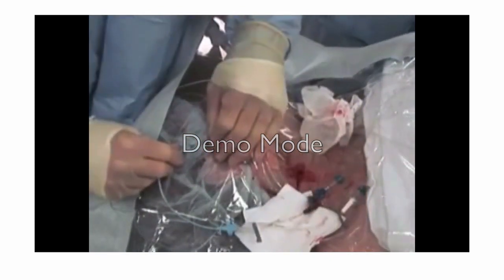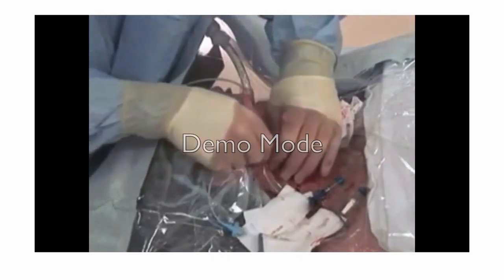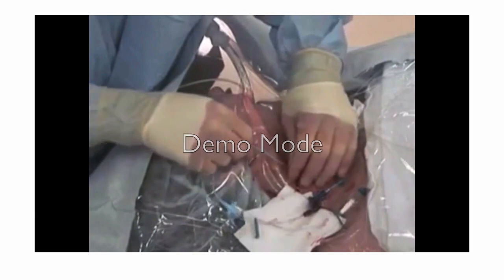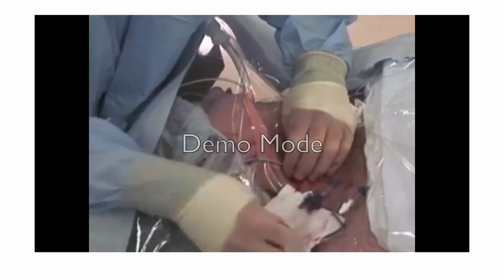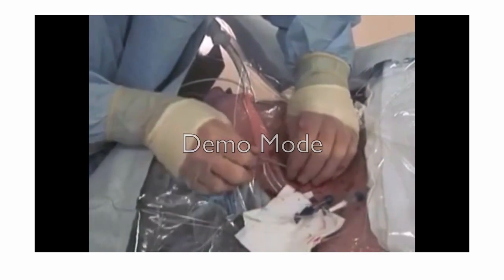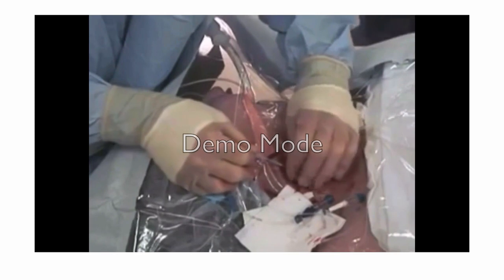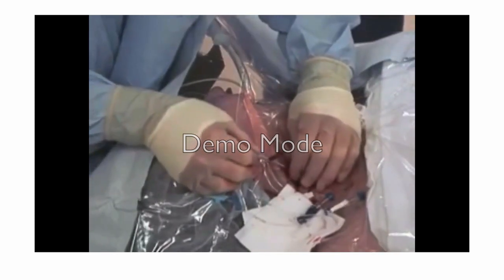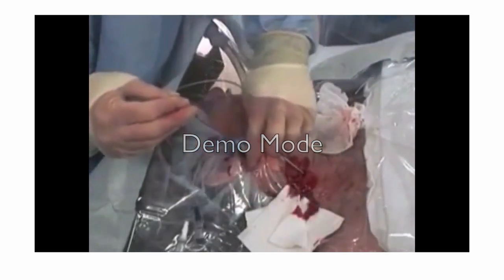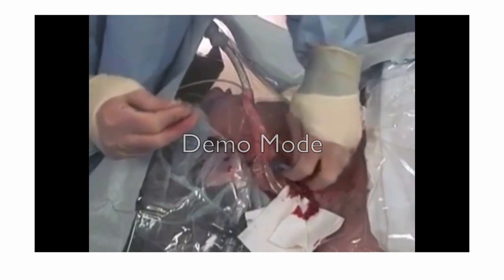And now insert your catheter. Make sure to grab the guide wire and not to lose it with the non-dominant hand. Push the guide wire a little bit out till you see the other end coming out from the hub of the catheter. Once you see the guide wire out, you should grab the guide wire from the other end and push the catheter all the way down to the vein.